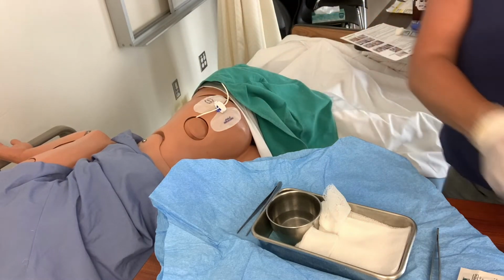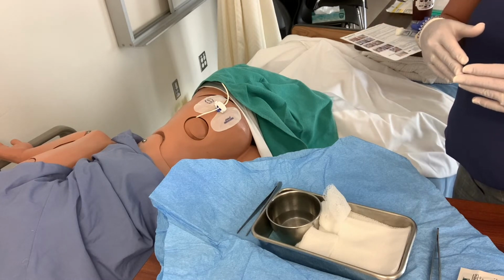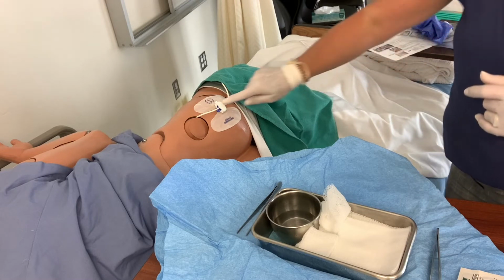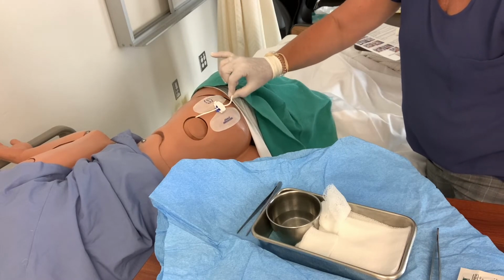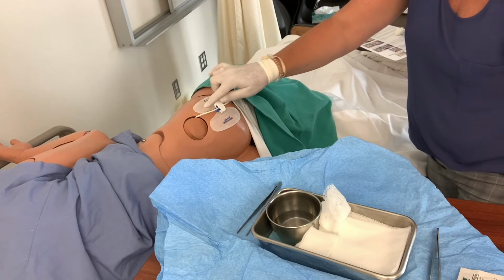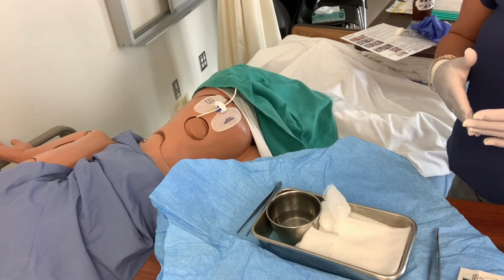It's sitting. My StatLock device is there. My percutaneous catheter is directly in the channel that it's supposed to be. The clip is clipped. It's been securely fastened. So if it takes a pull down here, it actually gets tugged here so that it doesn't pull on the insertion site. At this point then, I would apply my transparent dressing.